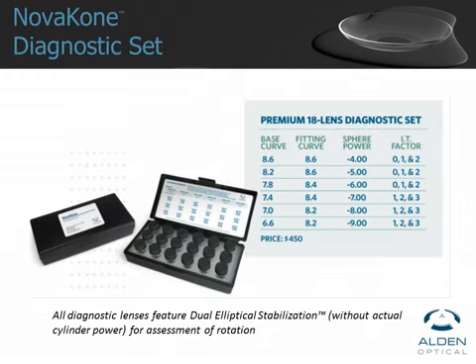This is what your diagnostic set looks like. It consists of 18 lenses, 6 base curves, and each base curve has 3 different IT factors. All of the diagnostics feature the dual elliptical stabilization, but they do not have any cylinder power. So it's easier to assess for the prescription over top and for that rotation. There will be dots at 3 and 9 o'clock to assess the rotation, and then you'll just do an over-refraction.